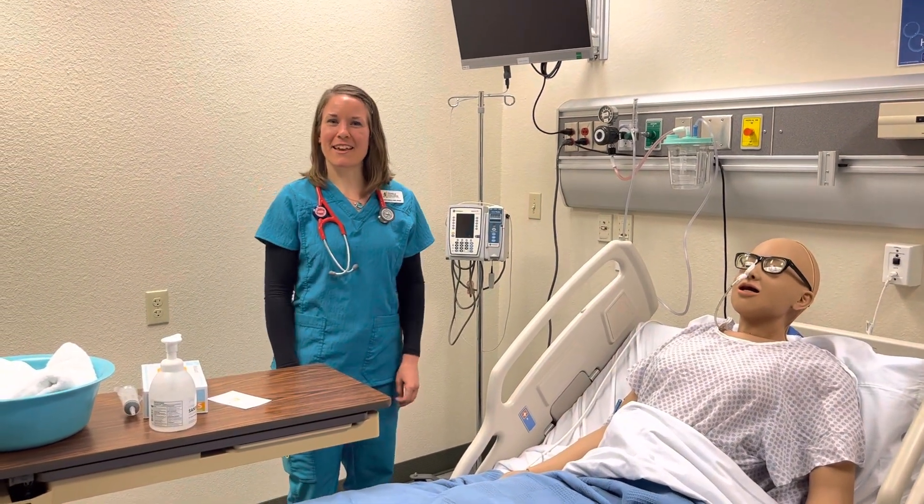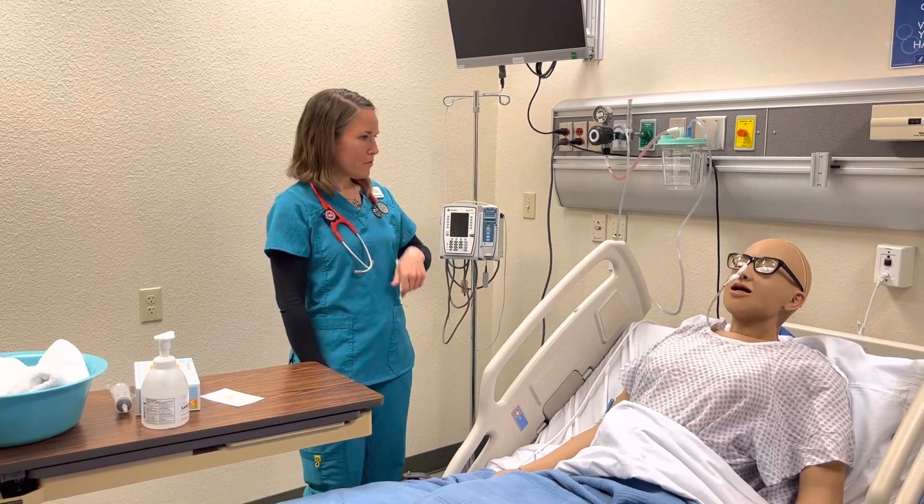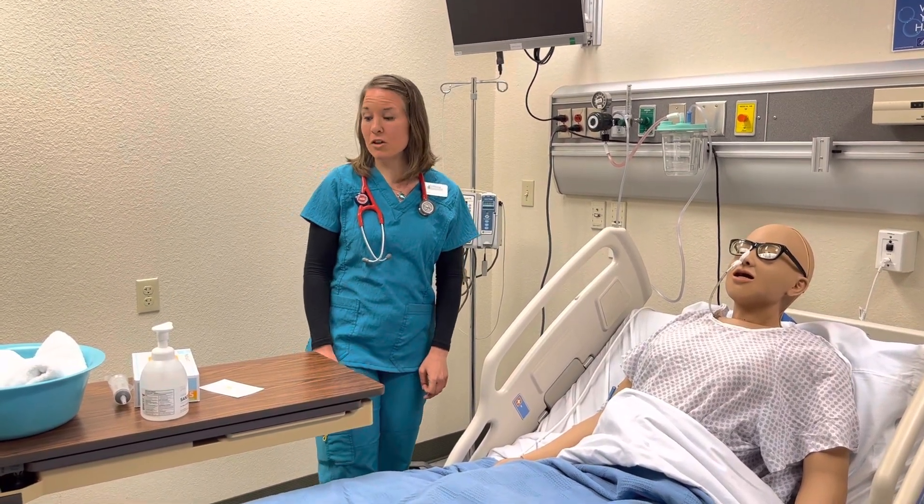Hi guys, Ms. Keesley again here. We're going to do a video now on how to remove the nasogastric or NG tube.